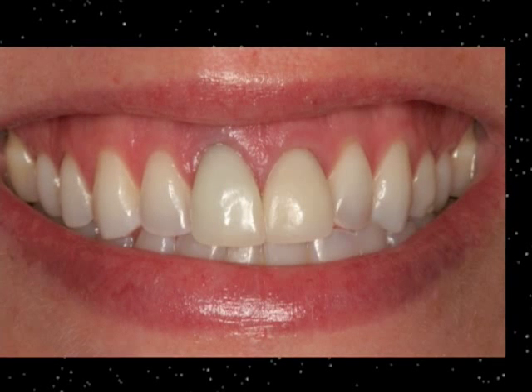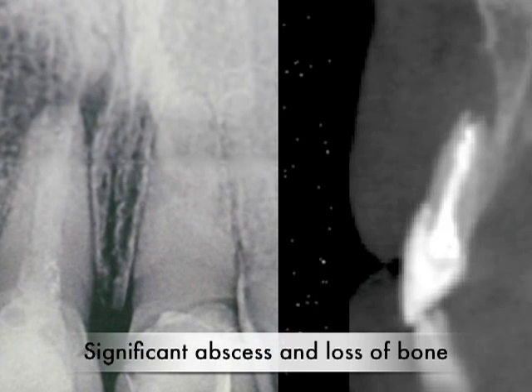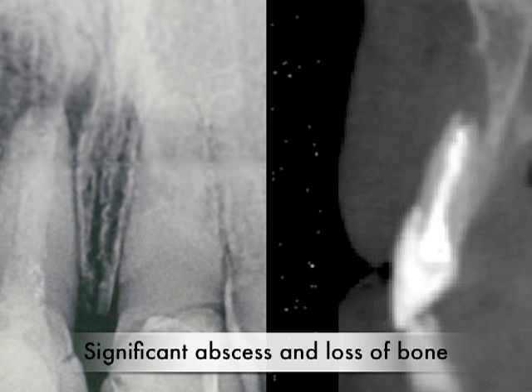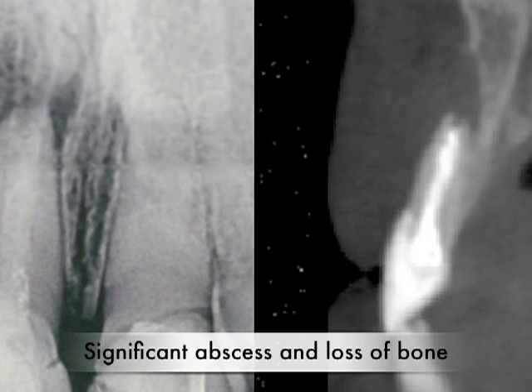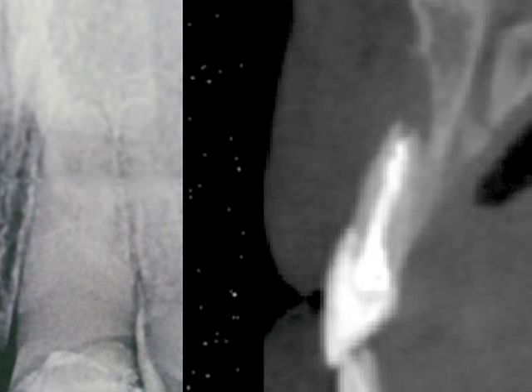And 20 years later, this root canal has failed and has caused abscessing or infections in her gum and bone, causing the loss of a lot of bone up and around this tooth with the root canal. So much so that there isn't enough bone to place an implant. So, one miracle at a time, what she realizes is that she wants to have an implant placed here and she needs to recapture the lost bone. So we provide an organized treatment sequence for her, and we manage the case in a very specific way.